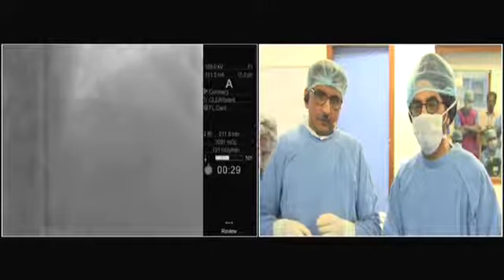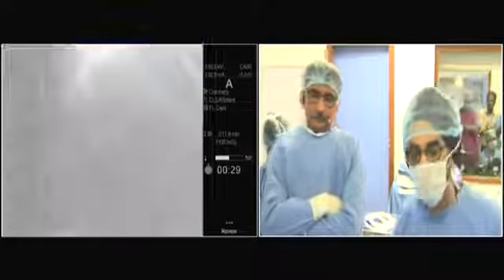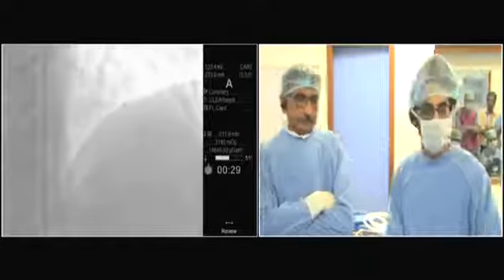Do you have stent boost? Yes, we have. I'll show you the stent boost. Can you take stent boost at this? Yeah. Yes, we have taken. So we'll show you.